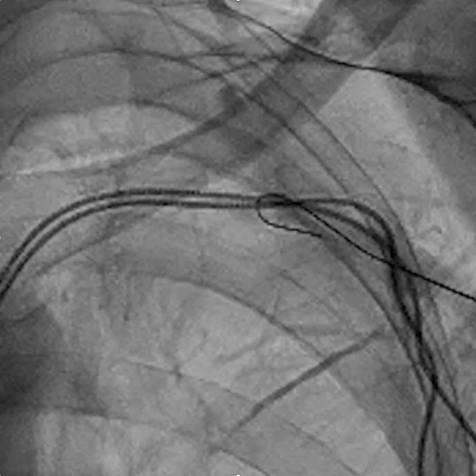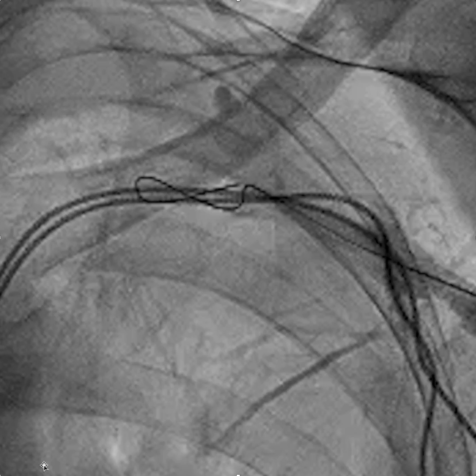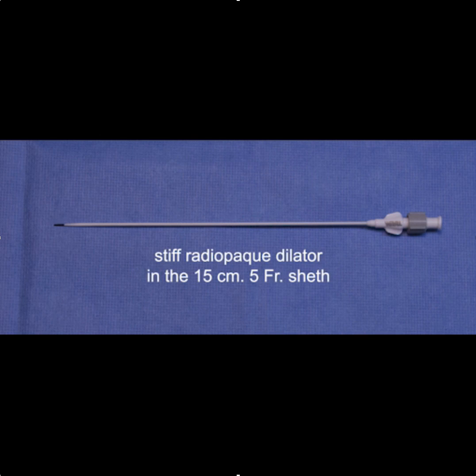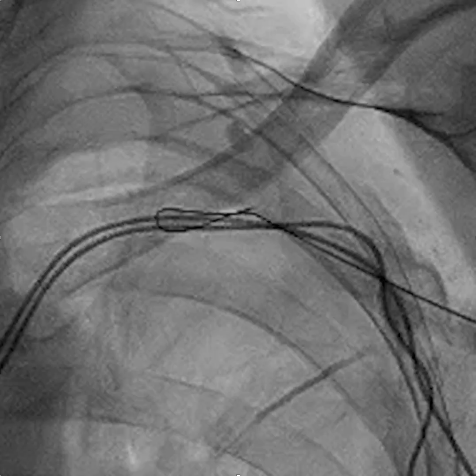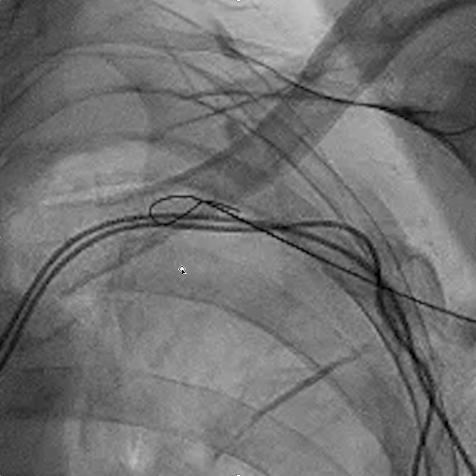We'll advance the wire to the point of occlusion and then carefully advance the stiffened dilator with 5 French catheter over the wire. Another nice feature about this stiffened micropuncture kit is that the tip of the dilator is radiopaque, so you can be sure where the tip of the dilator is in reference to the wire.